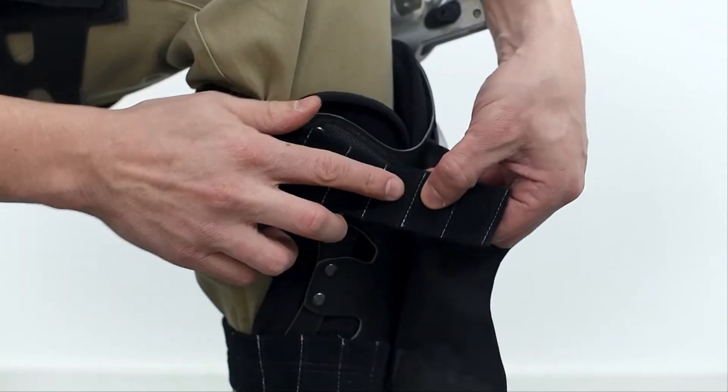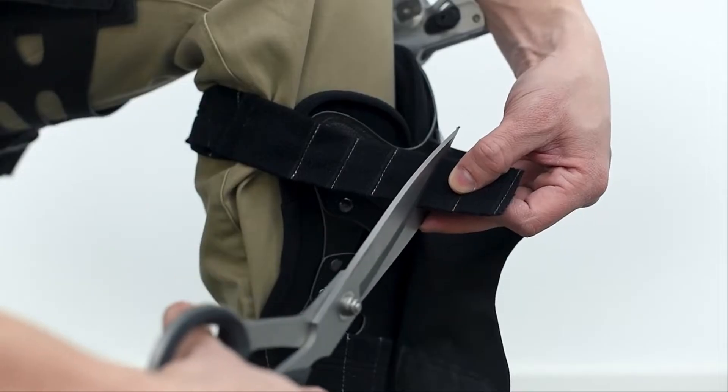If the straps on the shank harness are too long after putting it on, any excess length can be trimmed off.